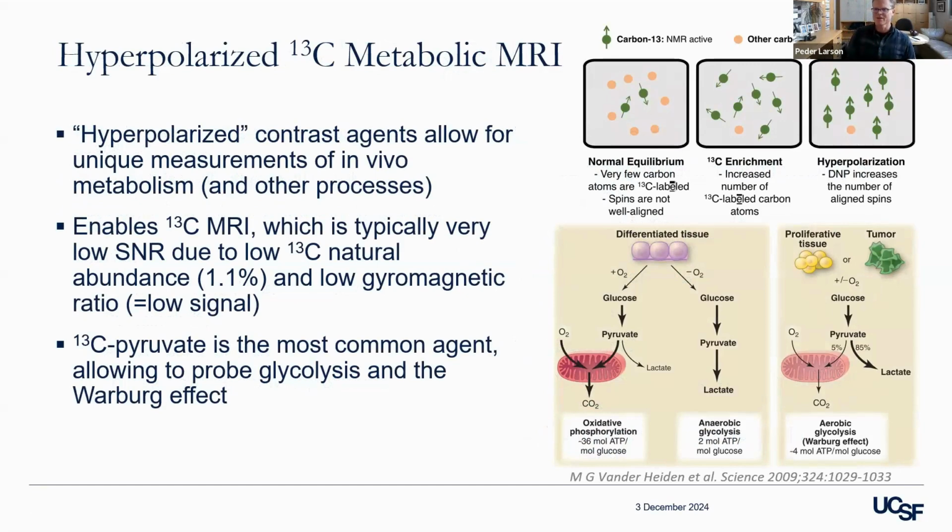So the background, your quick crash course in this technology: we do carbon-13 enrichment, given the low natural abundance of carbon-13, and we do this hyperpolarization process to increase the signal.